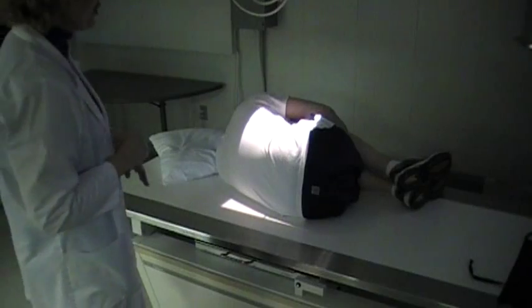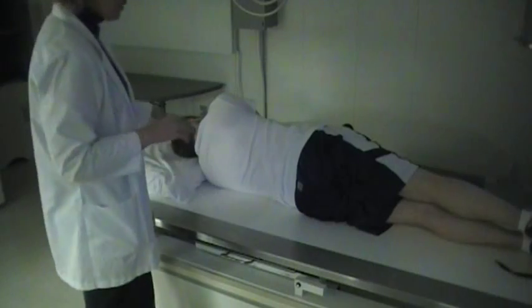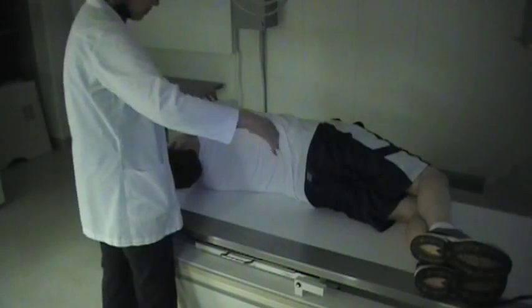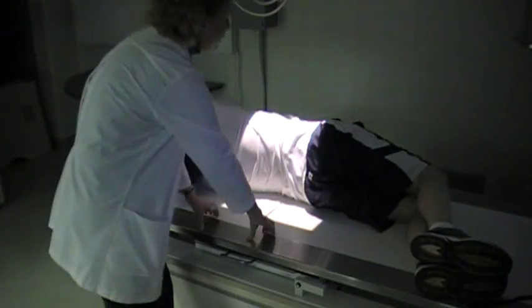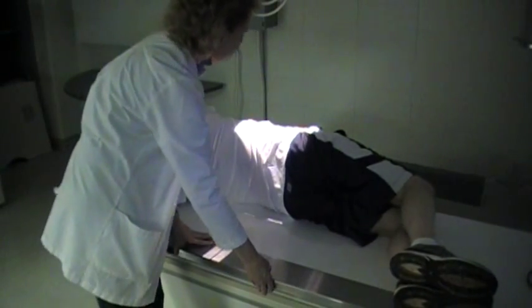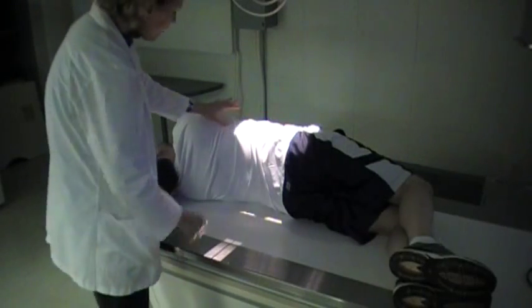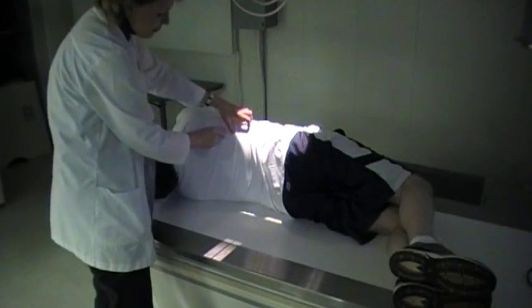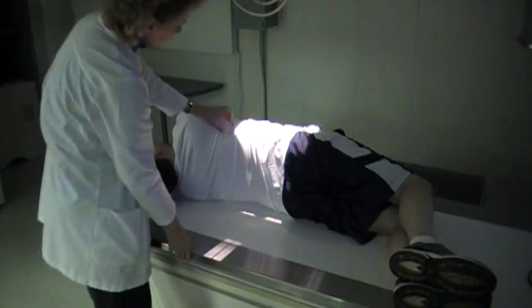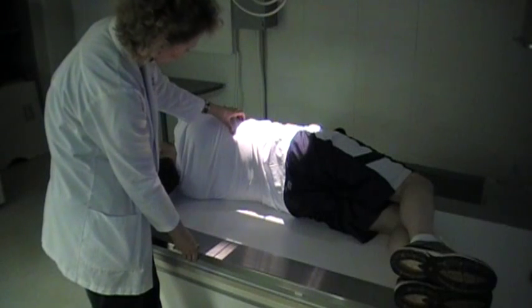For the hyperextension, you're going to ask the patient to straighten out and then arch their back. They'll bring the feet back, the shoulders back, and you can see how the back is arched. Center at the crest again. Go to the mid-coronal area, but check your right field and make sure you're not cutting something off. In this instance I might be, so I'm going to go a tad forward just to include that portion.